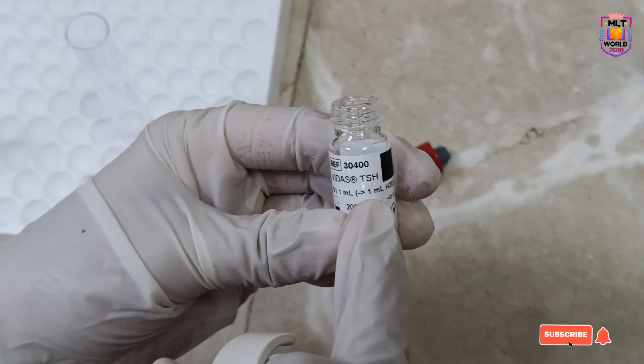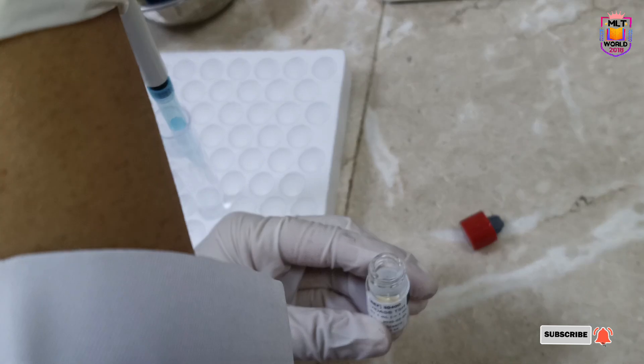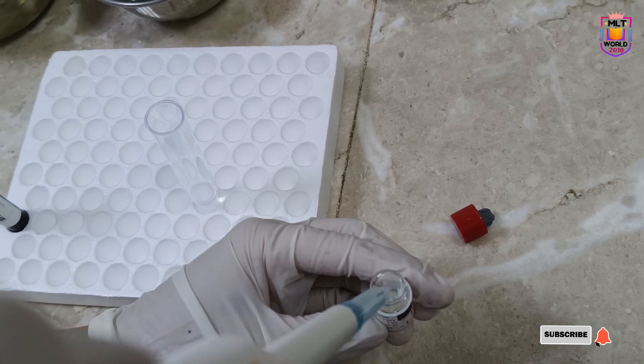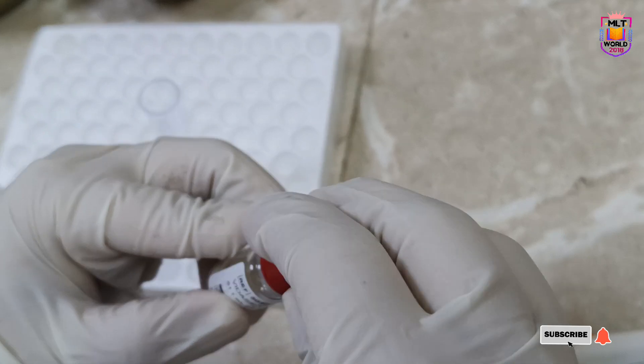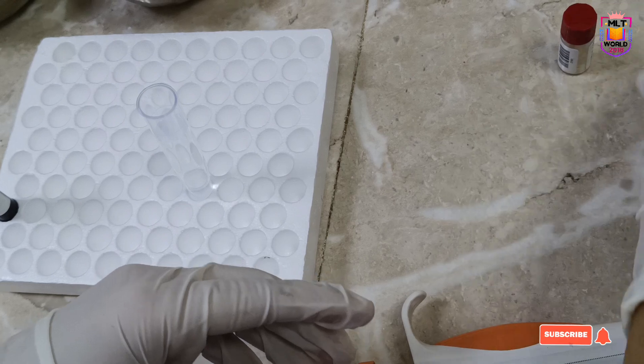You see here it's written. Always check the vial to see which type of diluent needs to be added and how much quantity. Another important thing: when you are pipetting and aspirating, keep the pipette straight, and when dispensing, keep it at a 45-degree angle to avoid bubbles.